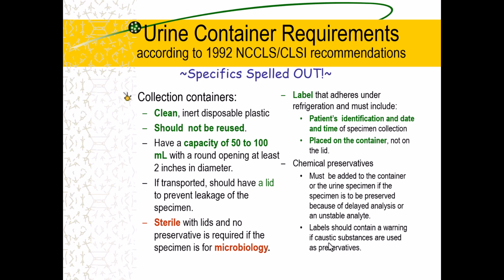Now, why this is a US thing: I taught in Tanzania for 3 months and was able to go to some of the labs there. They actually still use glass vials, tiny little Erlenmeyers. People have to pee in the Erlenmeyer, and they log them in, write their name, and put a number next to it. Then they write that number with a china marker, so that's their identification system. Then they pour it out over the urine dipstick, read the dipsticks, and then put it into a big bucket of bleach.